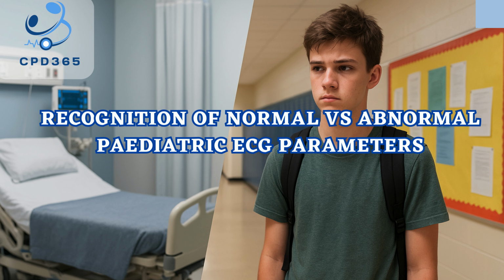Welcome to recognition of normal versus abnormal pediatric ECG parameters. This course has been developed to give you confidence in interpreting pediatric electrocardiograms, a skill that is very different from interpreting adult ECGs. Across the next 2 CPD hours, we will explore age-specific ECG values, learn to recognize normal variants, avoid common pitfalls, and apply a structured stepwise framework.